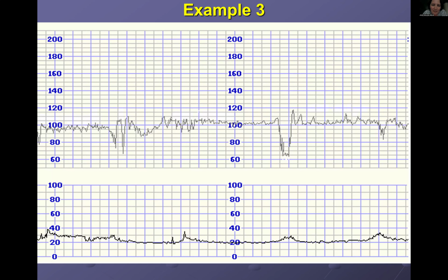So that's your DR. So doctor, what about the contractions? I'd say I see about 2 to 3. We're not seeing the full 10 minutes, but there are at least 2.